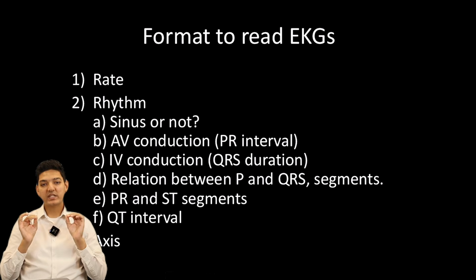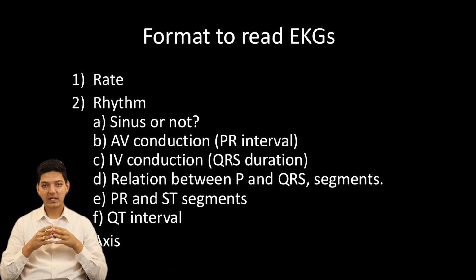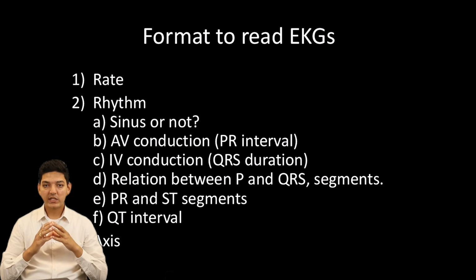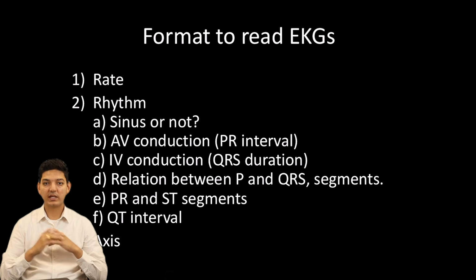Now we come to the most important slide of this video, and that is the format to read the EKGs. This is a standard format to read the EKGs: rate, rhythm and axis, and most people follow this with slight variation. And I promise you, if you go through this format step by step, even the toughest EKG will give you the answer. Even now at the end of my training, whenever I am stuck with something, if the EKG is complicated, I follow these steps and I reach the answer right away.